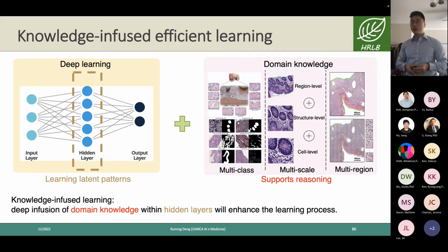To sum up the presentation today, we try to use domain knowledge of digital pathology images in the hidden layer design of deep learning models to achieve better performance for pathological AI.